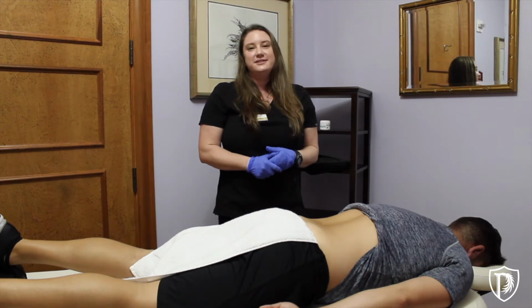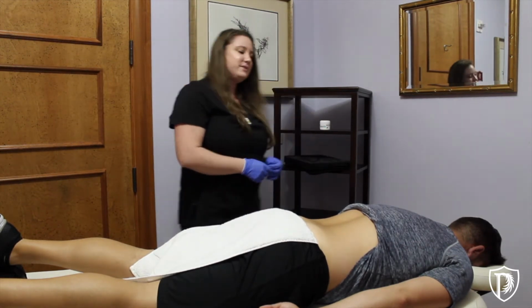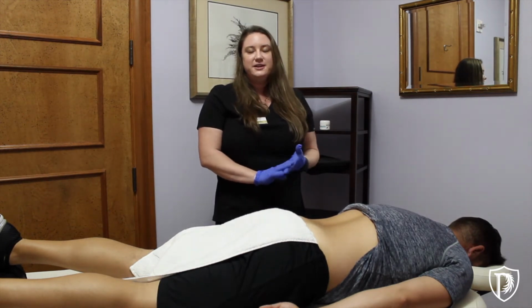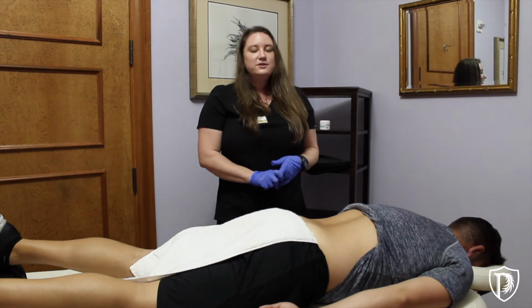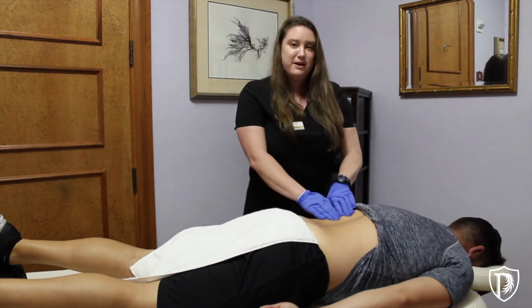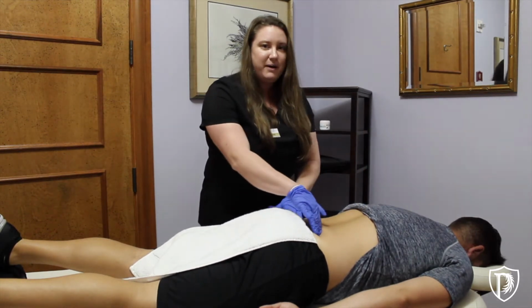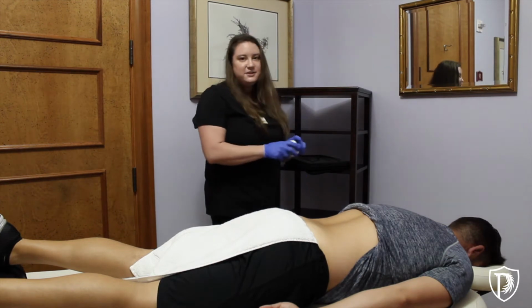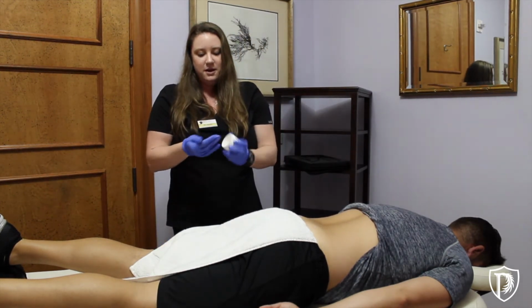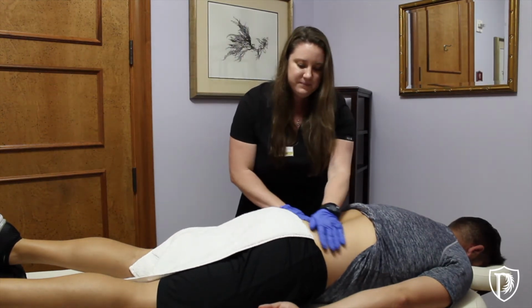So now I'd actually like to demonstrate how I use the Graston tools while I'm treating. So we have my patient here, and he's told me a little bit about his history, and he's got some chronic back pain. So some things we can expect with chronic back pain is we have some tightness here in the paraspinal muscles next to the spine, as well as down here along the pelvis. So the first thing I do is I take an oil-based emollient, and this just helps to decrease the friction between the instruments and the skin.